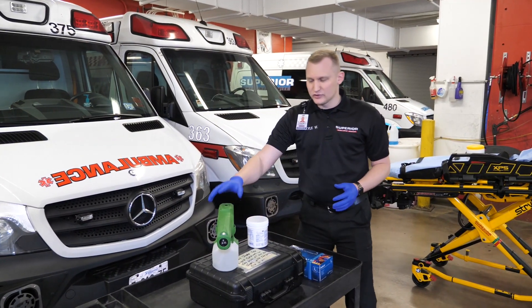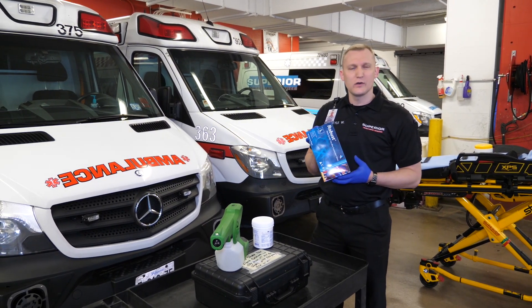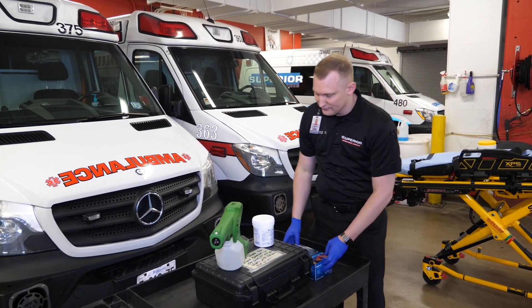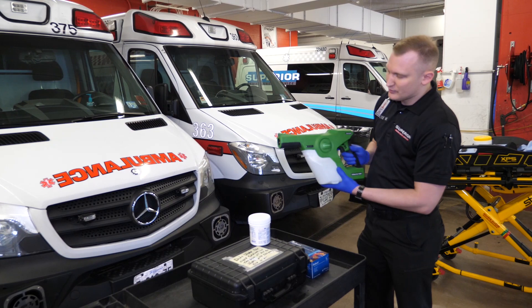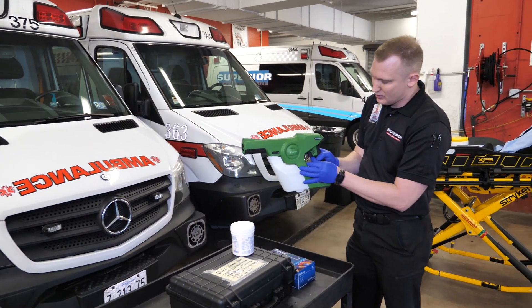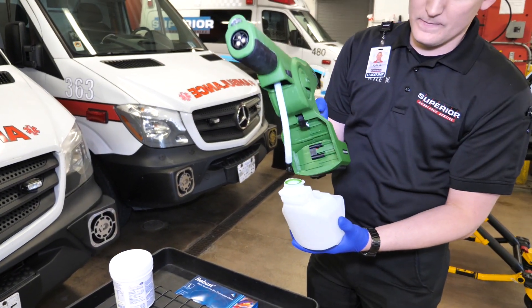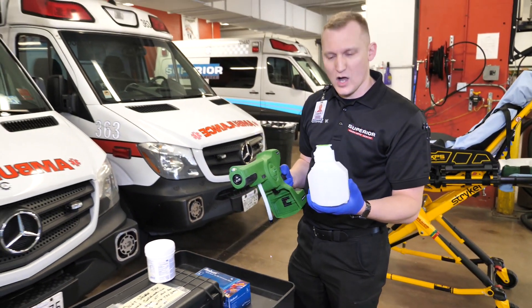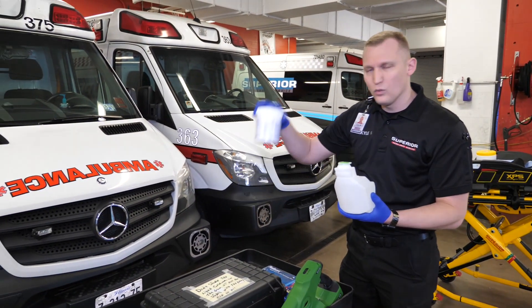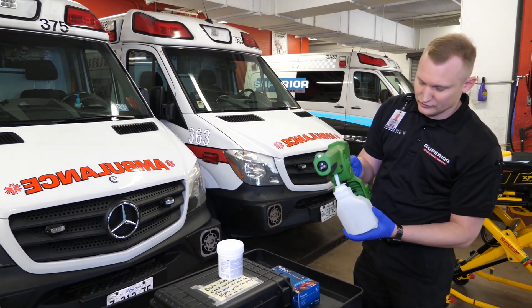Let's go over our Victory Electronic Decontamination Sprayer. To start, make sure that you wear a fresh pair of gloves. We start by first unlocking the canister, pulling the pin to release the canister. We fill this canister with water. We add one brew tab tablet to the canister and let it dissolve for five minutes to make the solution.